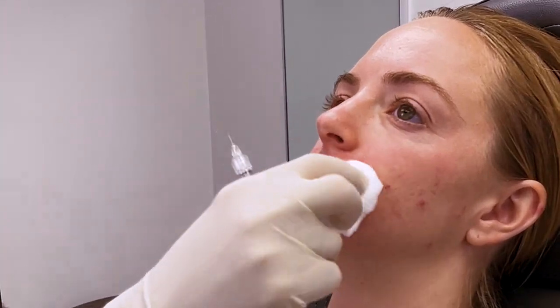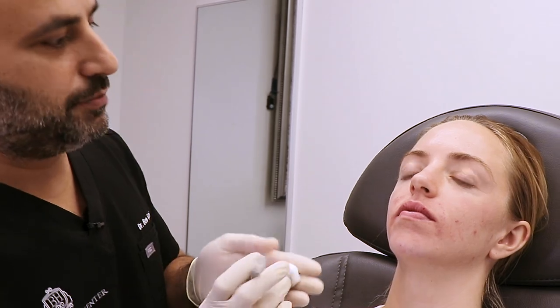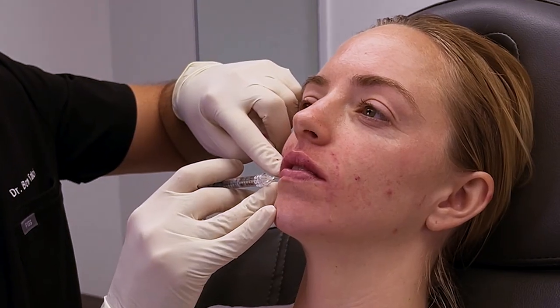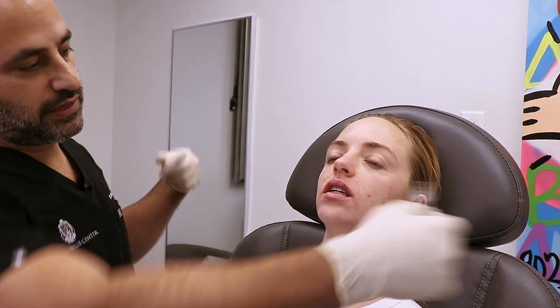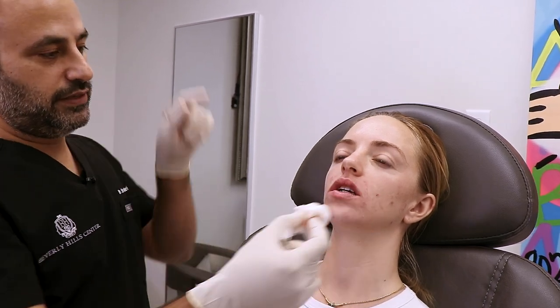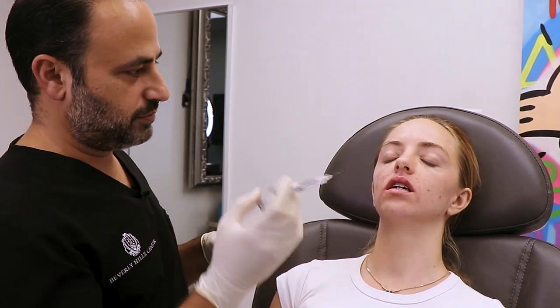Lower lip — close your mouth — doesn't need anything. She's matchy-matchy now. You can have the lips be about 50-50 or the lower lip bigger than the upper; you just don't want the opposite. You can add a little hydration right above the border — go from one side with a tiny bit and that goes to both sides. You do not want to go lateral on most people; it'll just make their mouth look like a sausage and look longer. Stay central. These are your two tubercles — two little pillows. You can enhance them by injecting directly into them just a little bit, but for her this is enough.